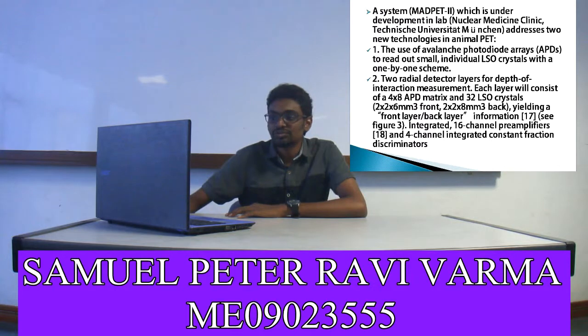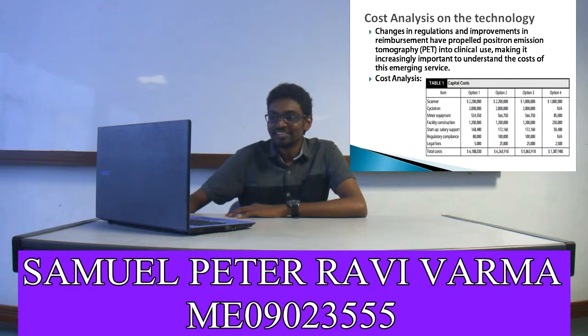The second one is two radial detector layers for depth of interaction measurement. Each layer will consist of a 4 times 8 APD matrix and 32 LSO crystals, yielding front layer and back layer information. The third one is integrated 16-channel preamplifiers and 4-channel integrated constant fraction discriminators.